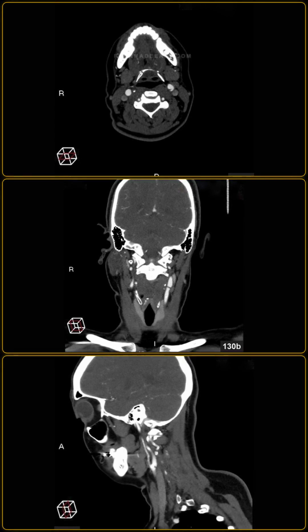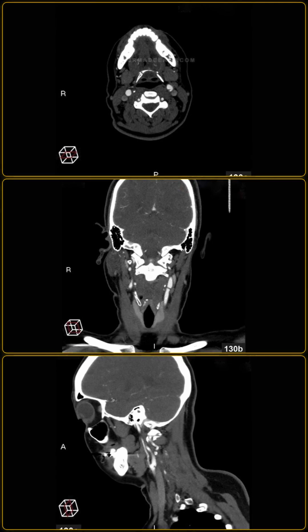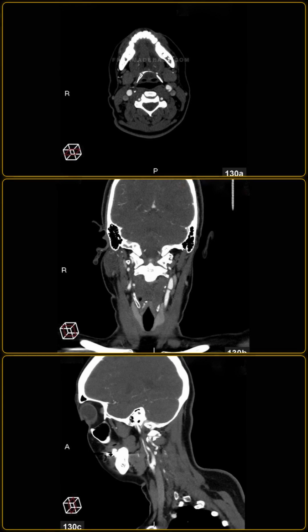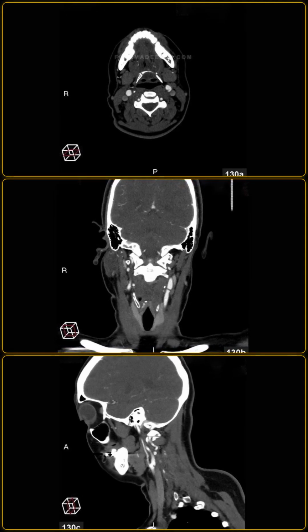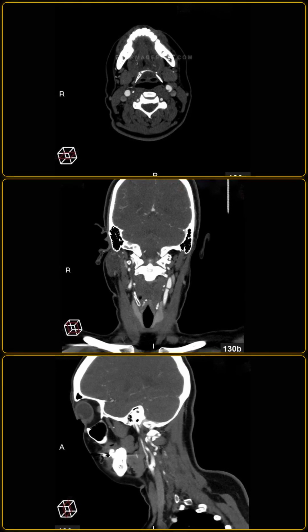Although digital subtraction angiography remains the gold standard, demonstrating early-phase filling defects and venous phase contrast pooling, CTA is the primary diagnostic tool due to its non-invasive nature. Additionally, because carotid webs can occasionally be bilateral, careful evaluation of the contralateral internal carotid artery is always indicated.